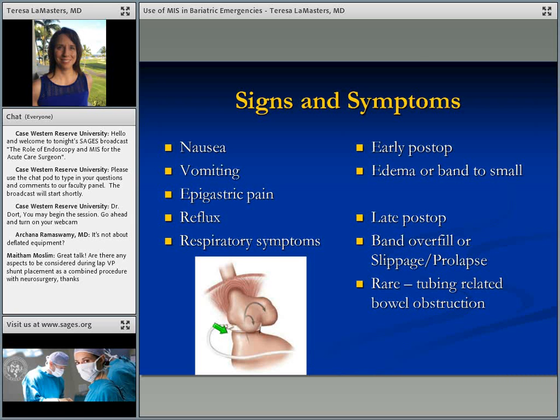So, in conclusion, you are very likely to see bariatric complications sometime in your practice. If you can, try to get a bariatric specialist to assist you, even if it's just over the phone. But many times the problem is going to be very high, near the diaphragm and under a large liver. So laparoscopy really is your friend in the morbidly obese population.